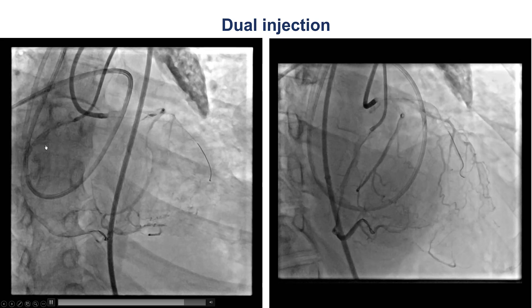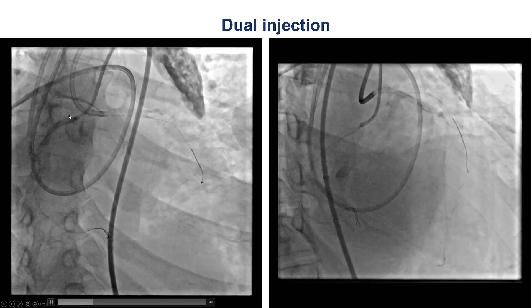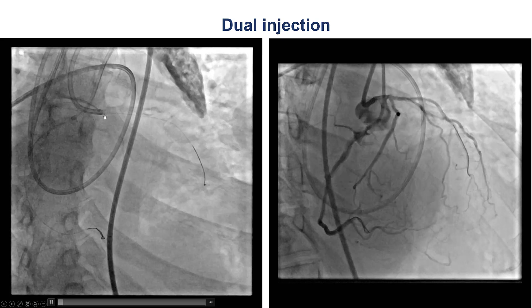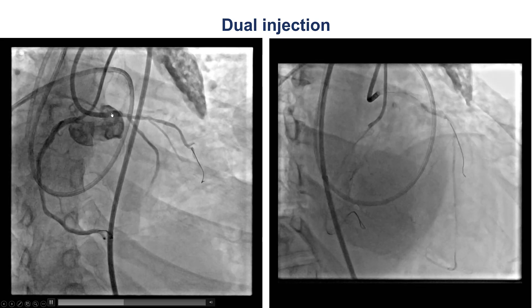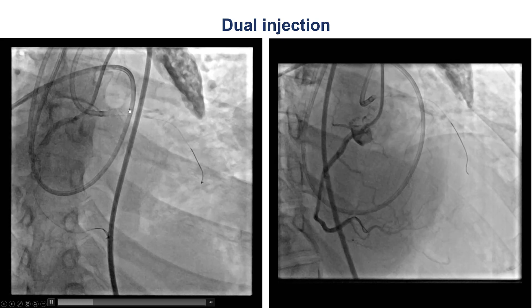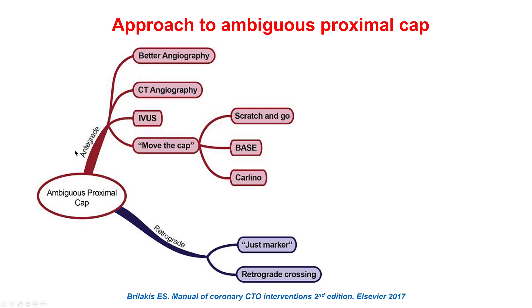We then moved our efforts to recanalizing the LAD CTO. On dual injection — injecting first from the right coronary artery and then from the left main — in caudal views we can see what may be an entry point into the CTO, with heavy calcification along the course of the vessel. Previously we often used a primary retrograde approach for proximal cap ambiguity, but the retrograde approach carries increased risk compared with antegrade crossing. Therefore, if antegrade techniques can be used, that is advantageous. Multiple projections suggested a likely entry into the CTO.